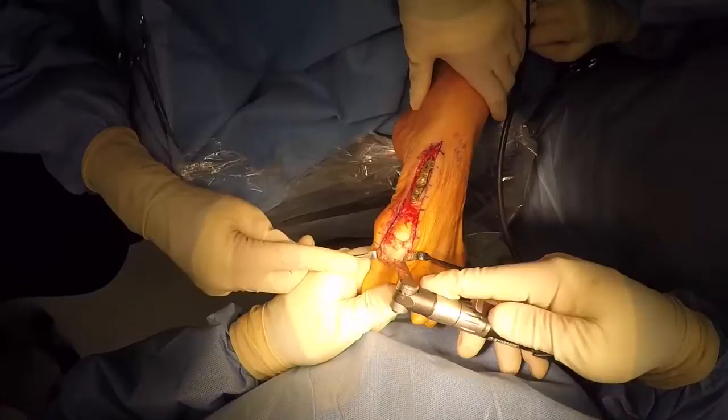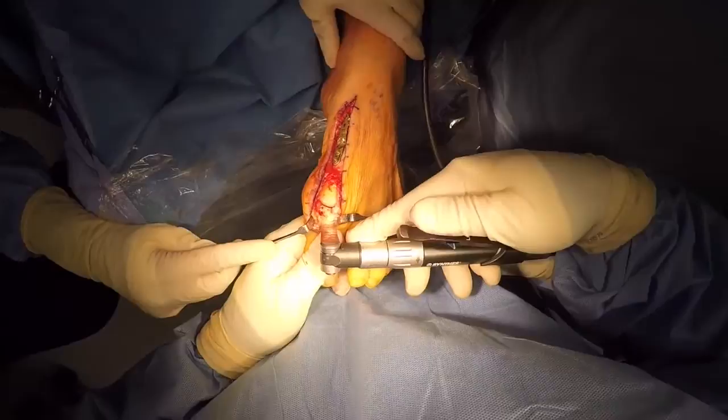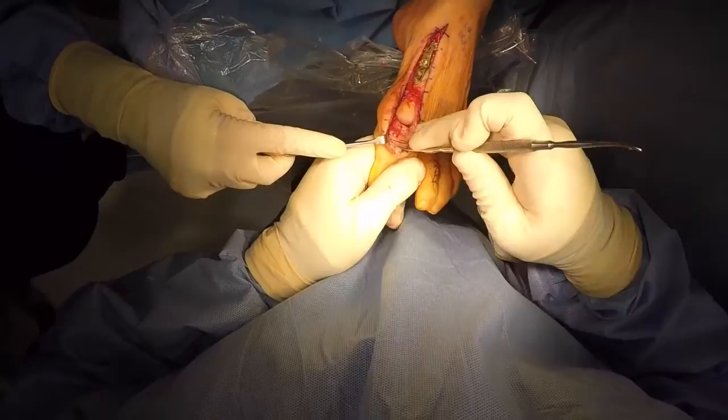We make our first cut for the Akin in the proximal phalanx just distal to the proximal flare, and the first cut will be perpendicular to the long axis of the joint, or roughly parallel with the first metatarsophalangeal joint surfaces. The second cut is made at a slightly oblique angle, creating a wedge with the base medial.